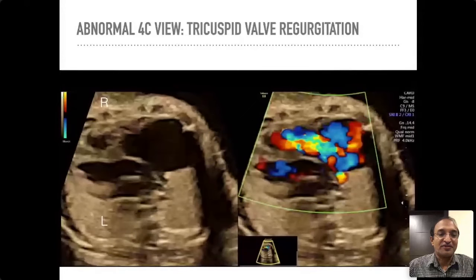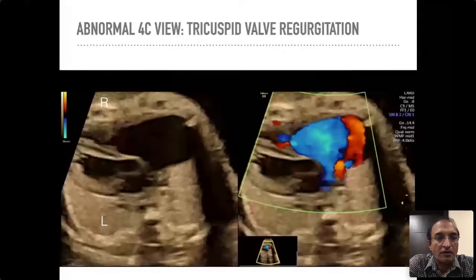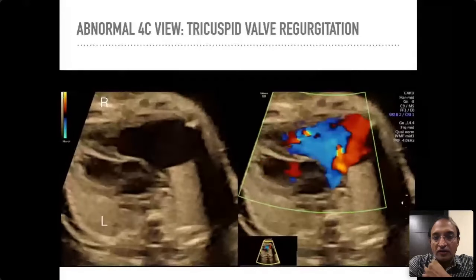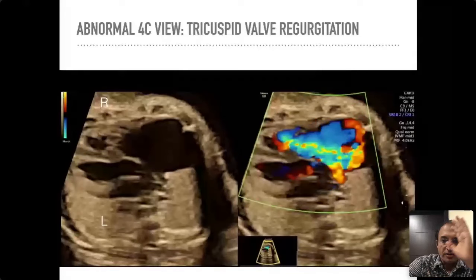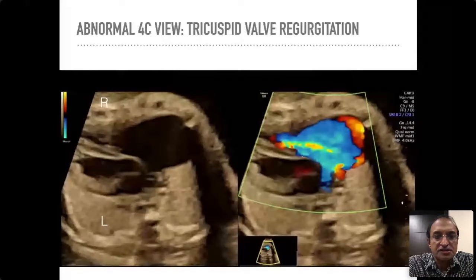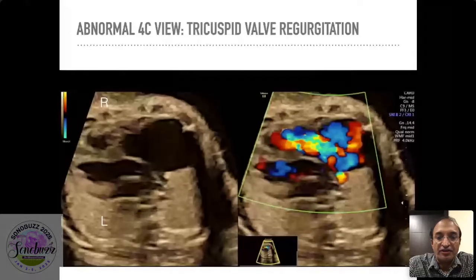So this is something which is very easy for most of you. A picture-in-picture on grayscale on the right side and the left side, and then the same with color on the right side. This is something which all of you will put as Ebstein's anomaly and severe tricuspid regurgitation. I just want to suggest that all tricuspid regurgitation need not necessarily be Ebstein's, so I'm going to bring in one more condition here for the sake of differential diagnosis.